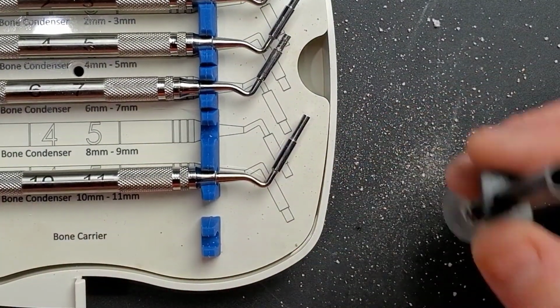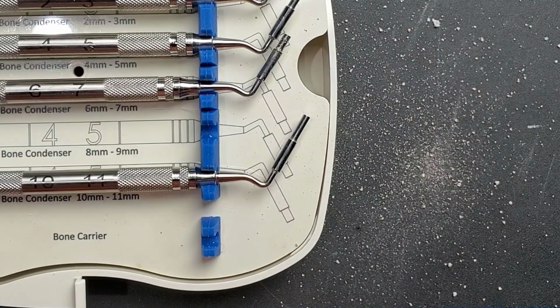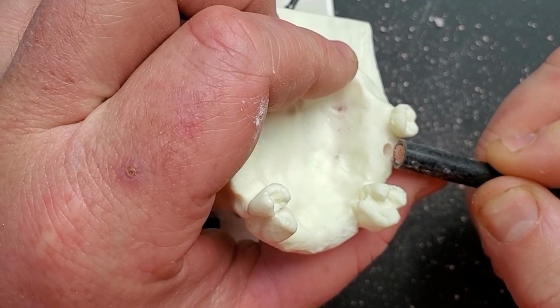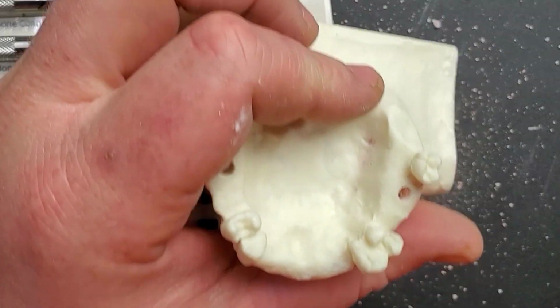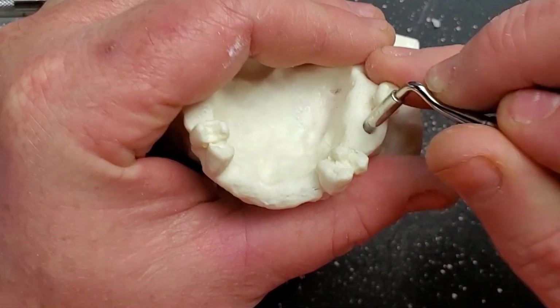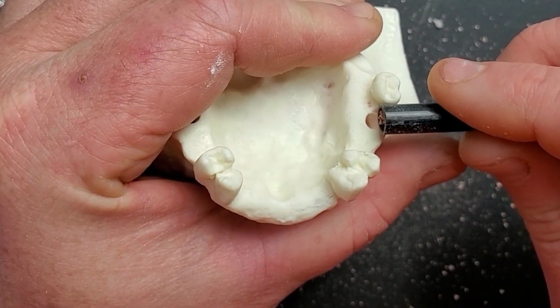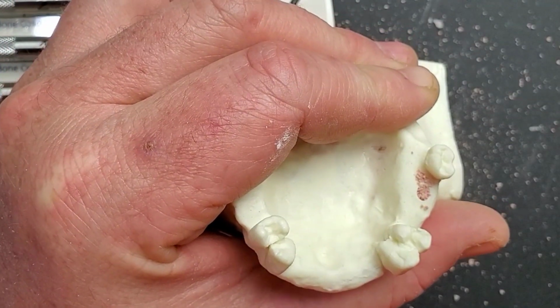Another thing you might consider using is a bone syringe. You can get these from most instrument companies. I really like using a syringe to introduce my bone because it's easier to control and you don't end up with as much wasted falling out in areas where you don't want it to. So another load of bone, 8mm side on the stopper, and I'm just going to do that wobbling motion to condense that. And then it's just back and forth, continuing to place more bone as we go.